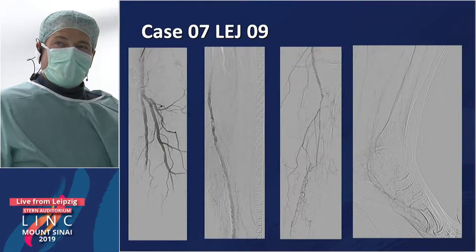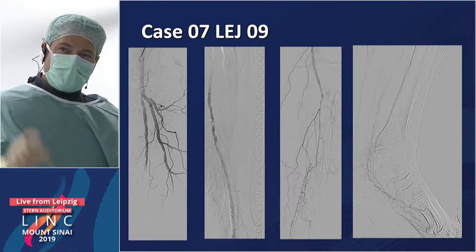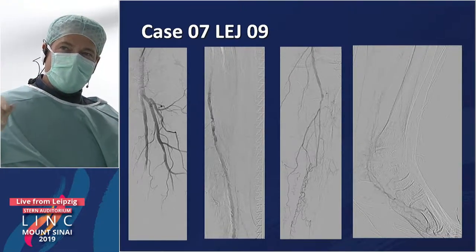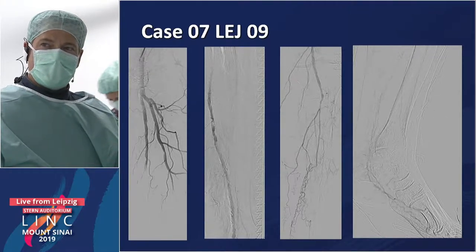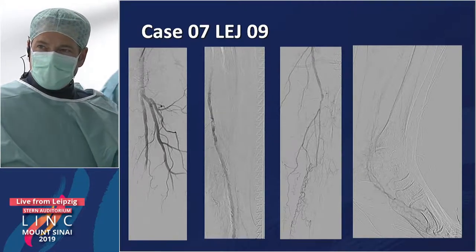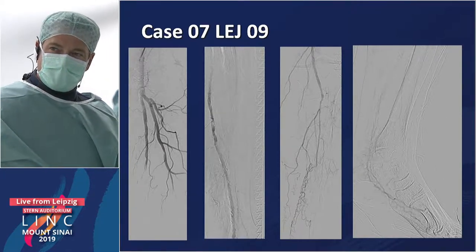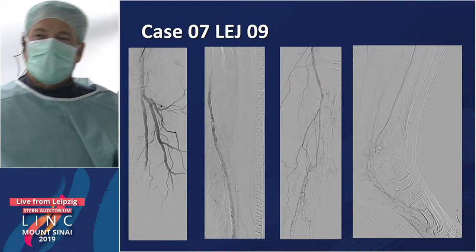This is an angiogram from a few weeks ago. The left proximal SFA is open and patent, but there is a subtotal stenosis in the mid portion of the SFA. Below the knee, every vessel is occluded, but the posterior tibial seems to be the main one reaching down to and feeding the foot.